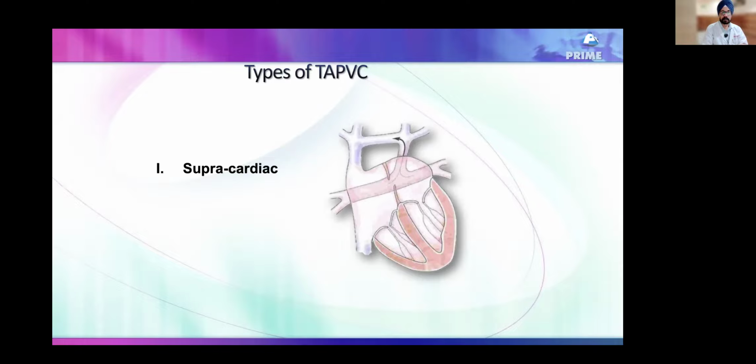So many times that chamber does not get absorbed. Okay, so now pulmonary veins open into that chamber, and that chamber opens into the left atrium. But now what we have is a cor triatriatum. You see the membrane, it did not get absorbed. You getting my point?